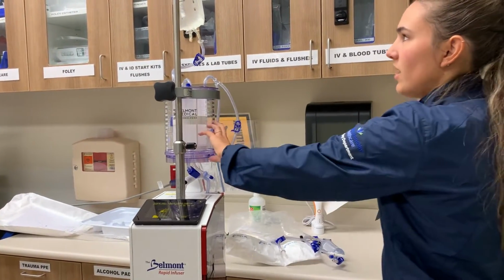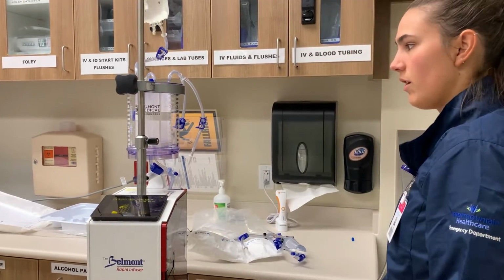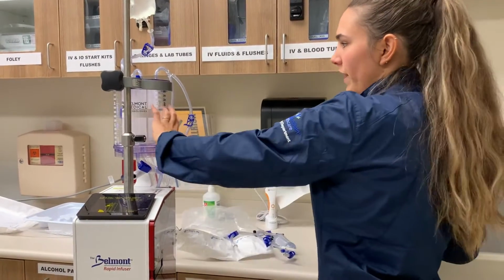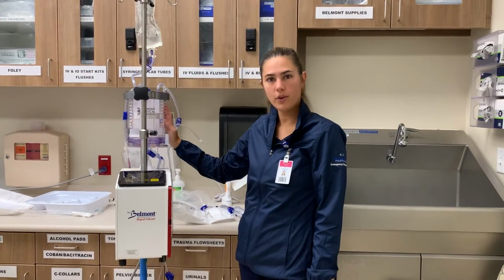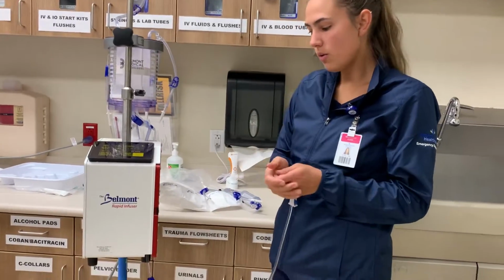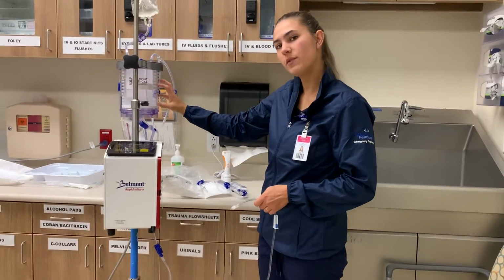Now it's a 3-liter chamber. We only have about a liter going, so it's really only going to go not far up, but you get the idea. If you had more fluids or more blood attached, it would fill up a little higher. So we've reprimed with the 3-liter reservoir rather than with that chamber that was part of the tubing that we had before. This was already good before we switched it to the reservoir.